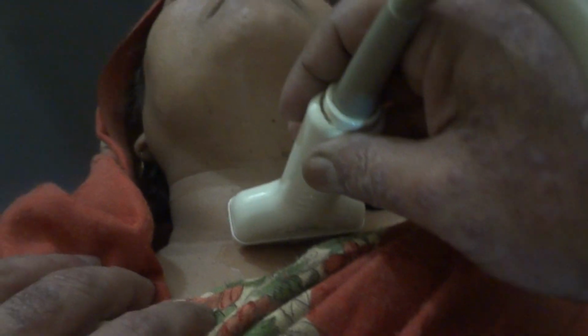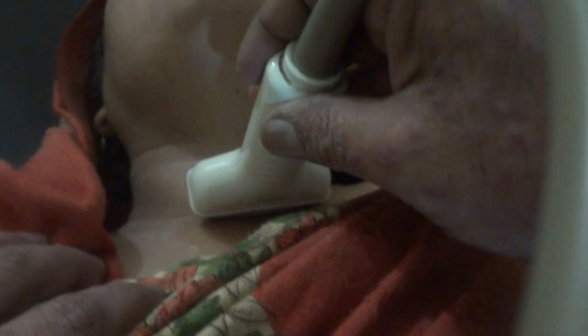Another technique is to see the thyroid in total in transverse view. You can get both lobes together and then get hold of one, move the probe towards the right or the left lobe and angle it 90 degrees from there.